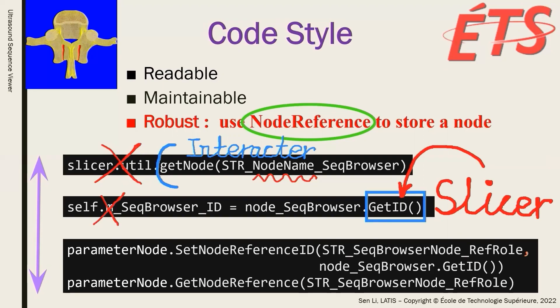The best way to store a node for persistent node reference is to call the function setNodeReferenceId and getNodeReference. You can specify any string as a reference role of your target node according to your own preference.